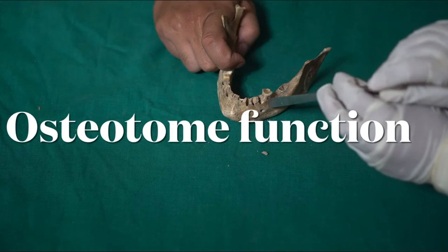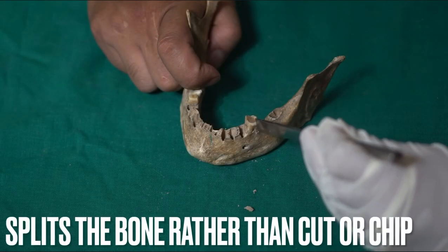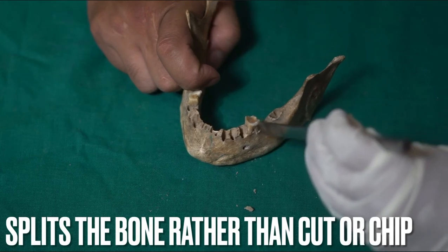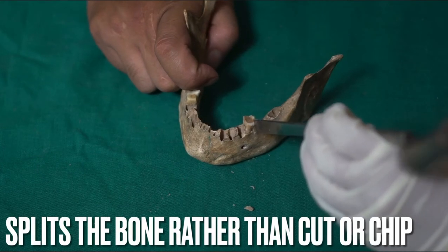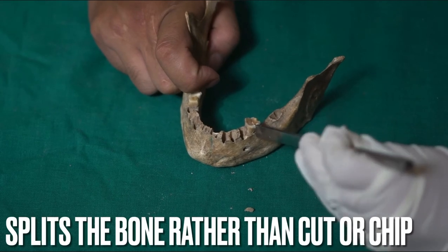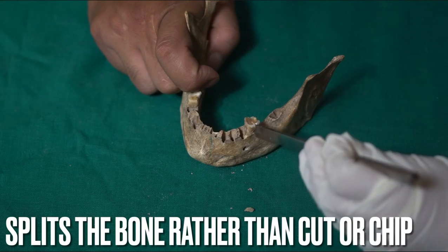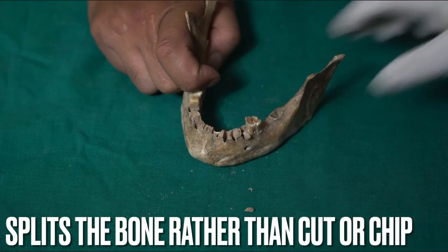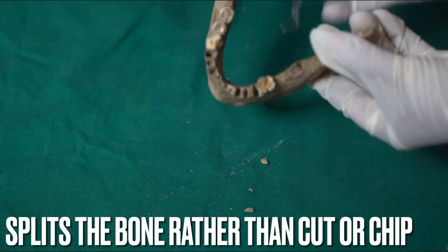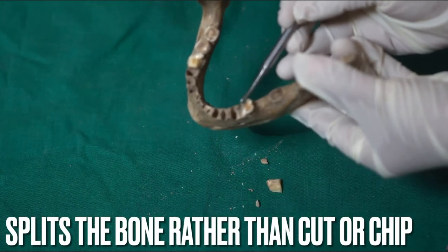The osteotome, on the other hand, is used to split the bone as a whole. As shown with the tooth example: when splitting on the buccal side, it will also split on the lingual side. Unlike the chisel — where only the buccal side is cut — with the osteotome, splitting on the buccal side causes a split on the lingual side as well. So it splits the bone or tooth as a whole whenever you mallet it.